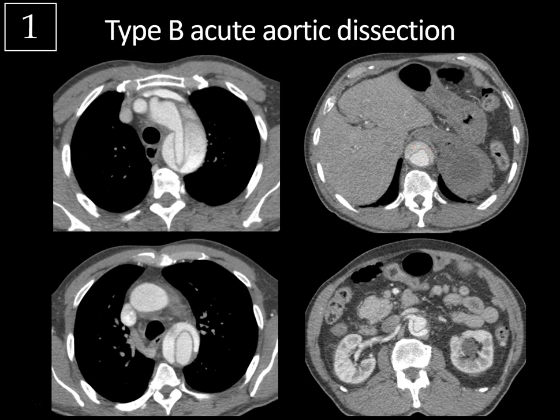You can tell this is an acute dissection because the intimal flap is bowed. In a chronic dissection it tends to straighten out and the false lumen will slowly thrombose over time. The right renal artery is coming off the true lumen, which is typically the case, while the left renal artery often comes off the false lumen. Always check if the dissection flap occludes the renal arteries — you might have a renal infarct — and also check for extension to the mesenteric vasculature.